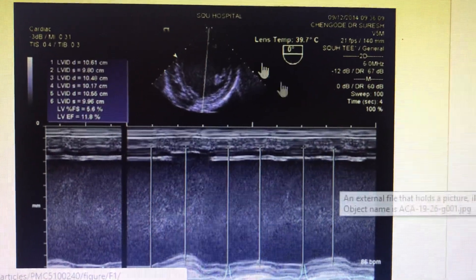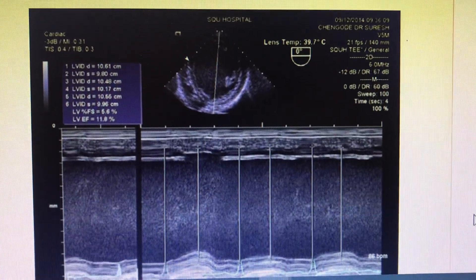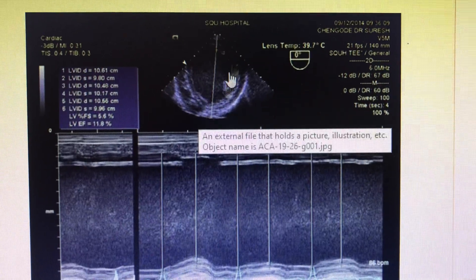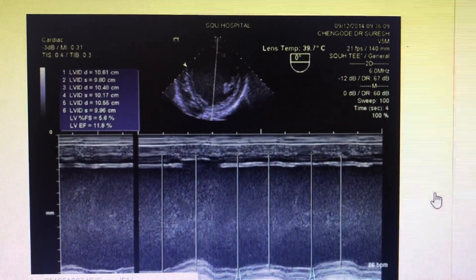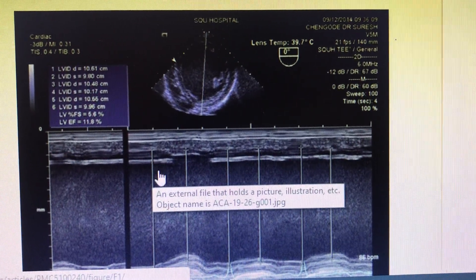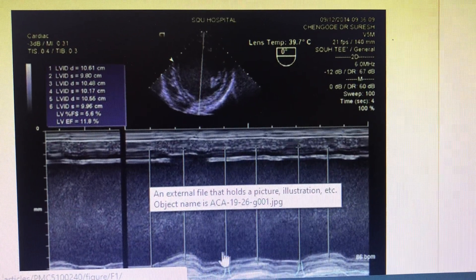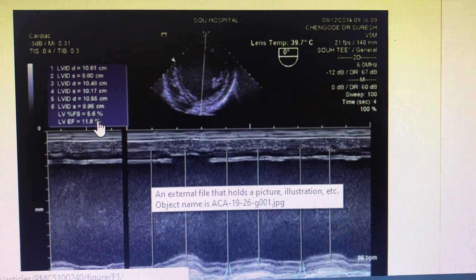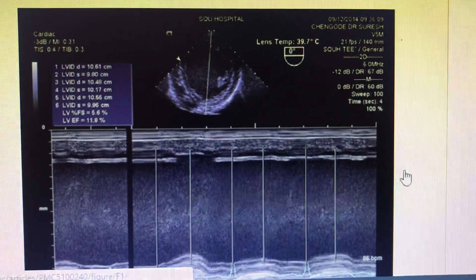Here you can see the actual echo parameters we usually see on the echo screen. You can take measurements in the short axis or the parasternal long-axis view. The cursor is in M-mode, and you take all measurements in diastole and systole — it will measure the LV fractional shortening and accordingly the LV ejection fraction as well.